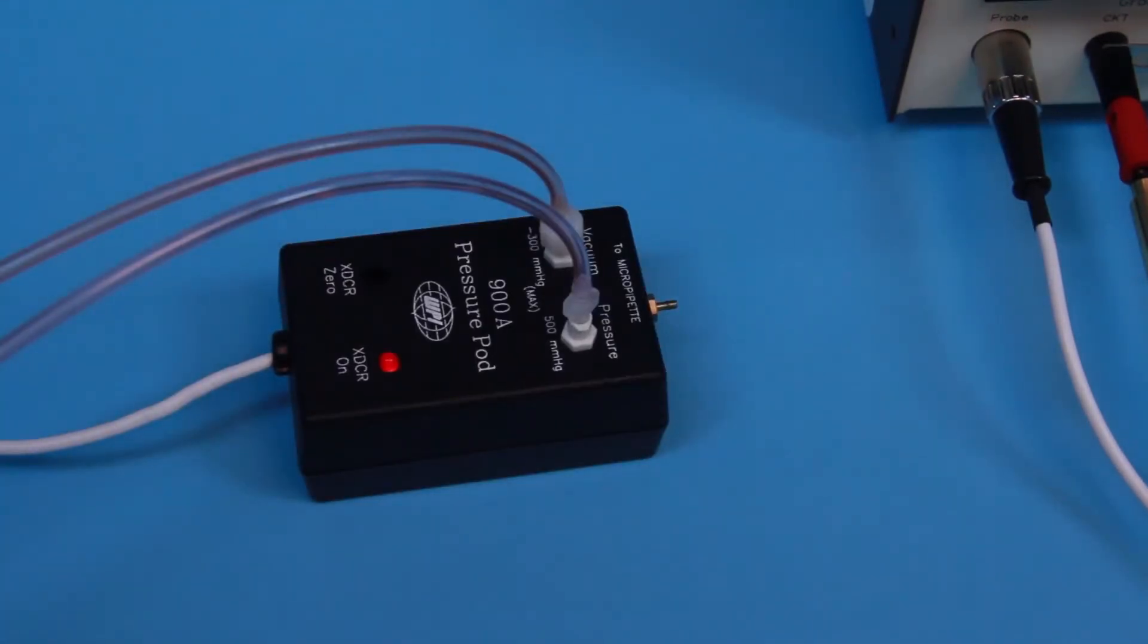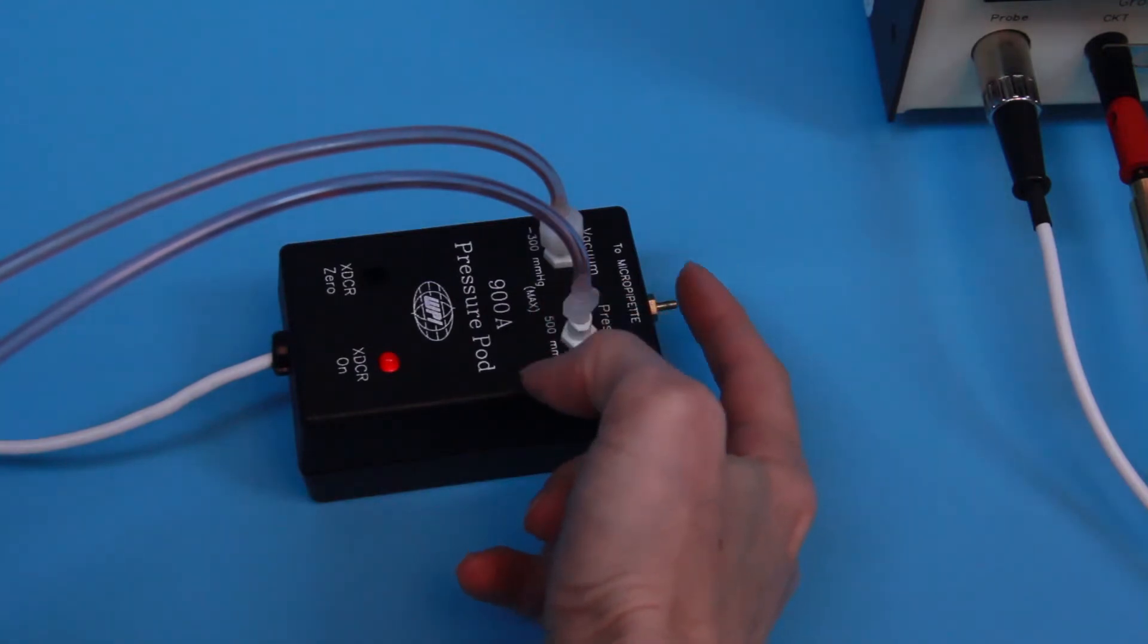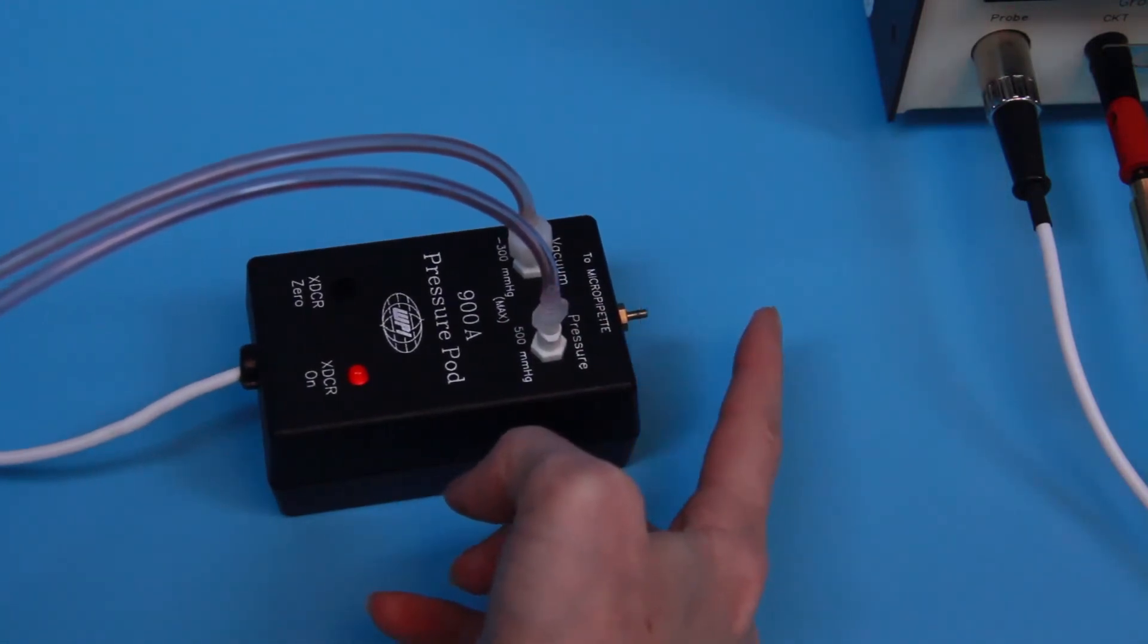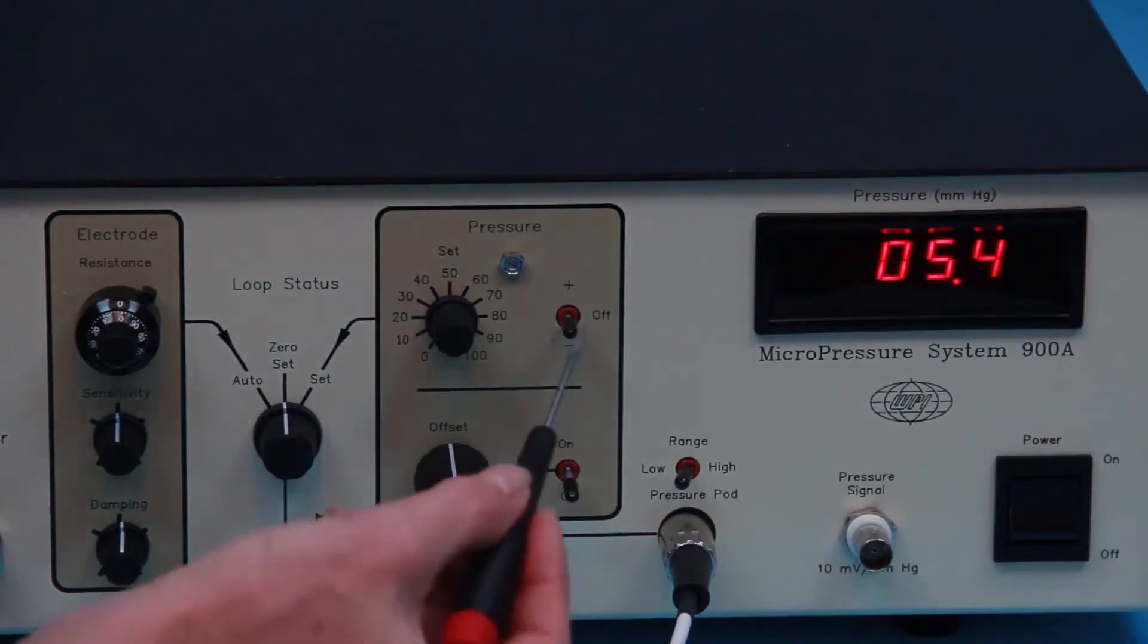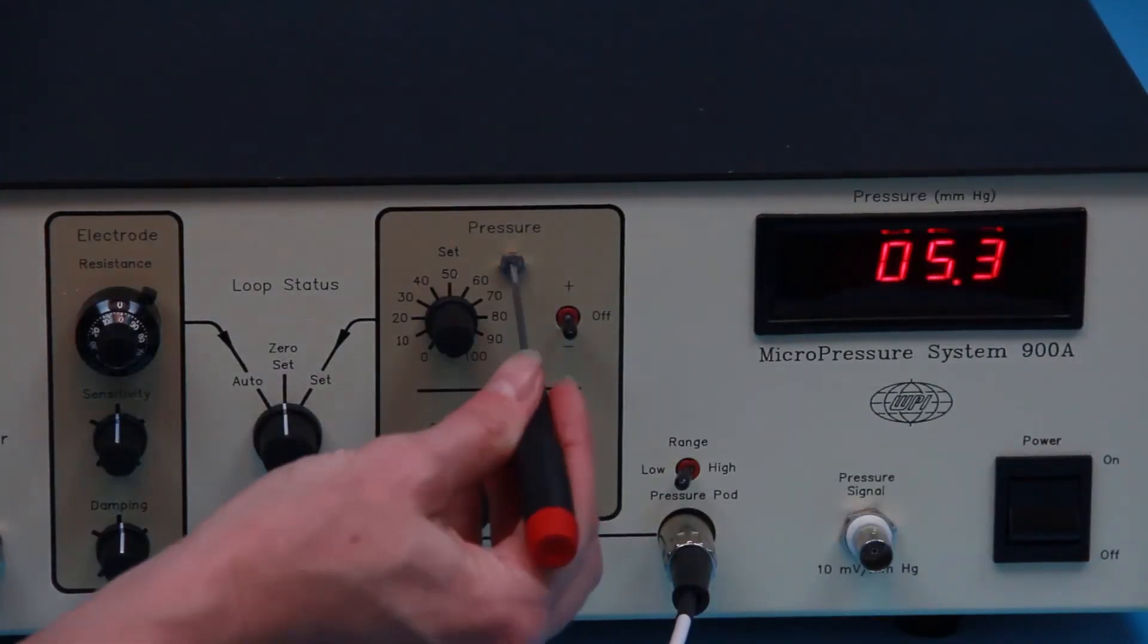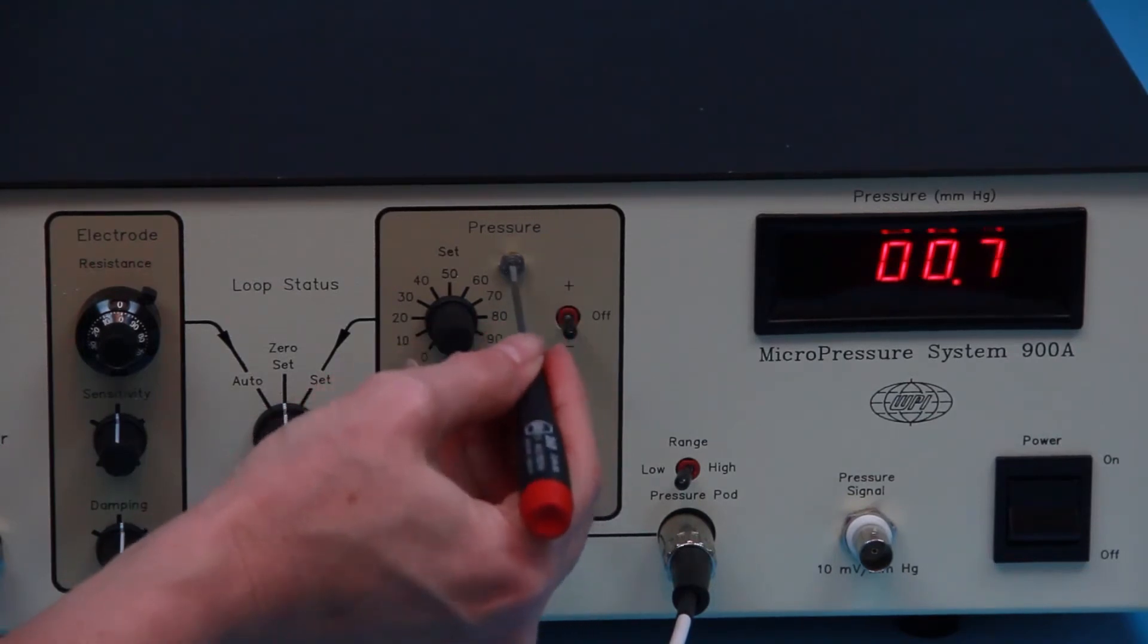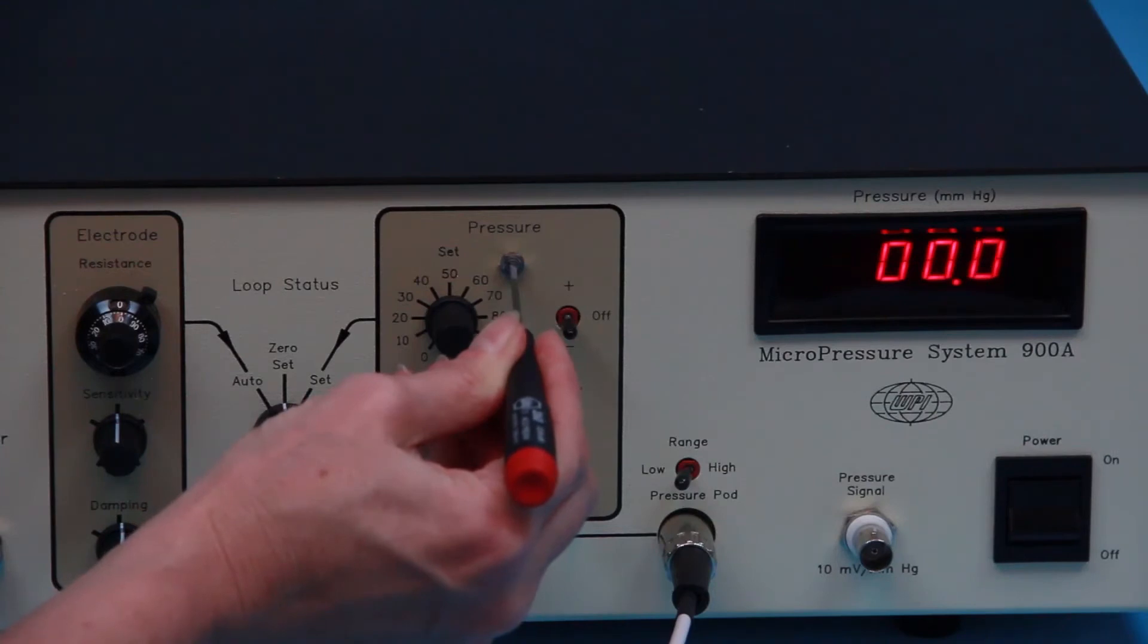Block the 2 micro pipette port on the pressure pod. A finger can be used for this operation if it's held firmly against the port opening. While the port is blocked, insert a screwdriver into the recess marked pressure on the 900A front panel and turn clockwise or counterclockwise until the digital meter reads zero millimeters of mercury.